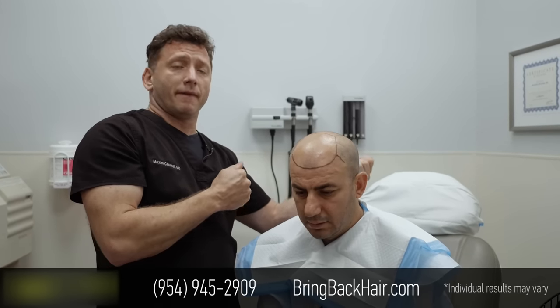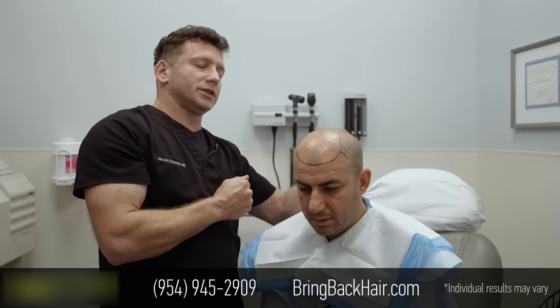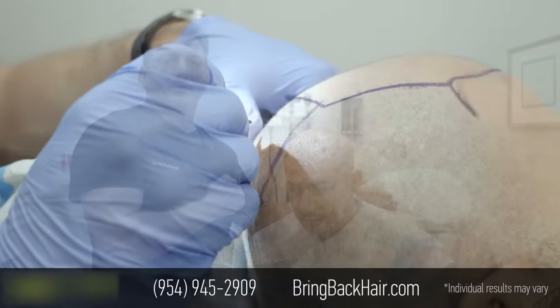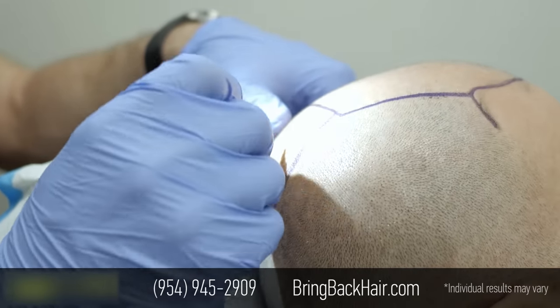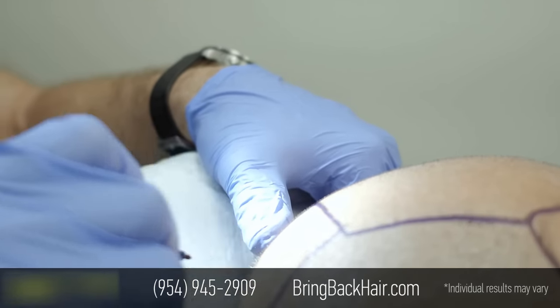This is the day before the actual procedure. We're going to start tomorrow with robotic harvesting and placing. I'm in the process of creating a design of the vortex, and it's a little more tricky because the hair changes direction several times in the back.